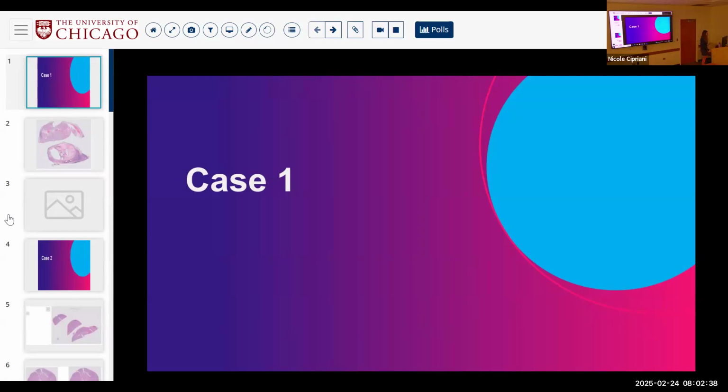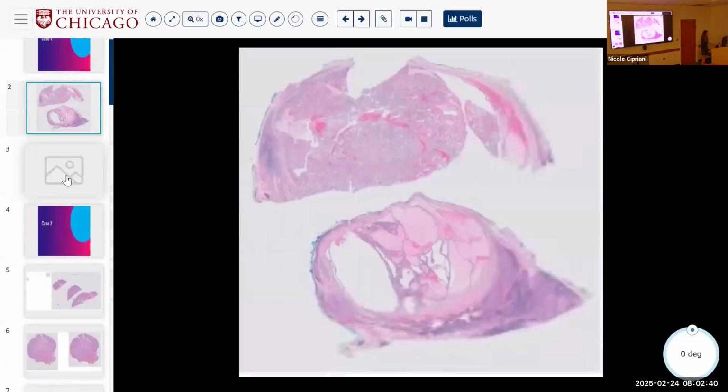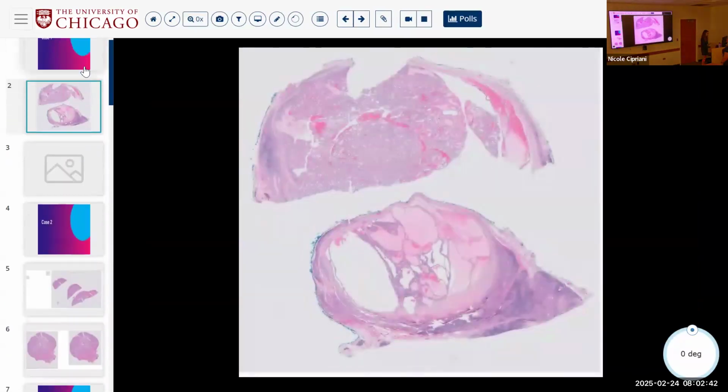So you're gonna do case one, and I didn't give you histories because, I don't know, it's a thyroid nodule in a person. And besides that, not too much for this unknown set matters, so go for it. Alright, so just for low power, there's macro follicles and micro. And it looks like it's sort of trapped. So I see a kind of a capsule around it.